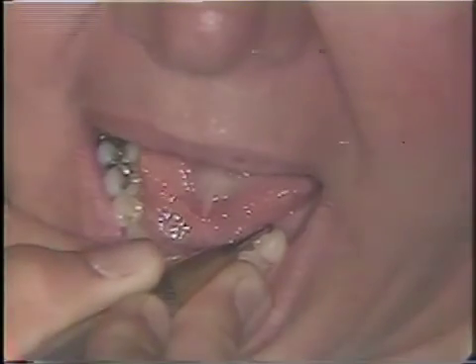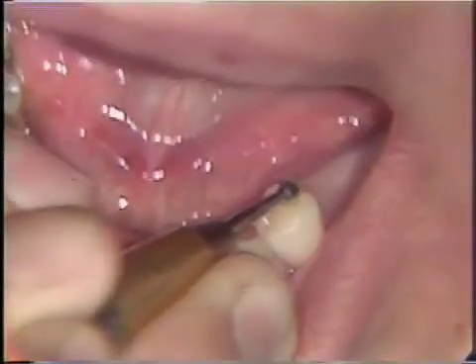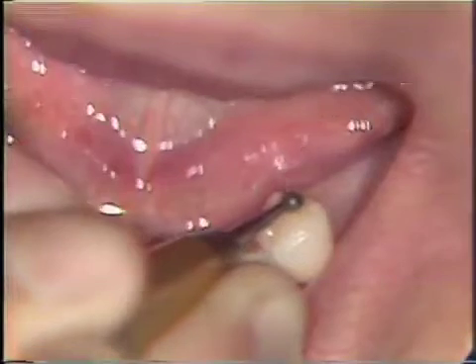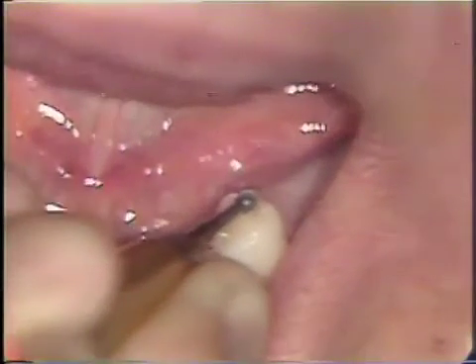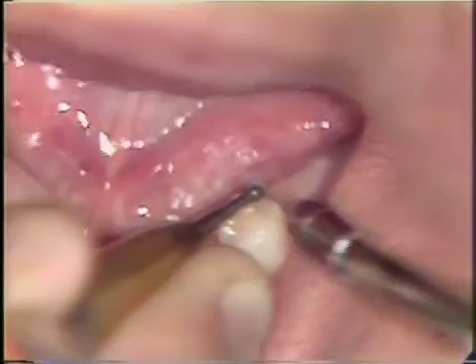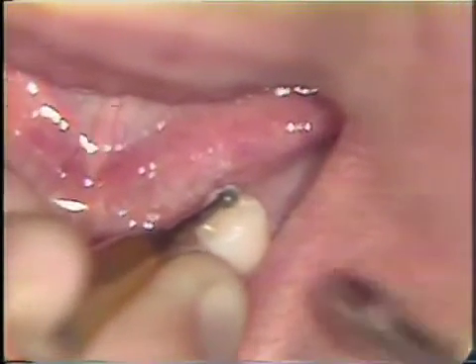On the patient, the occlusal rest is placed with a number 6 carbide burr, round. It could also be placed, if it were on a molar, with a number 8 carbide burr. The patient is not anesthetized for this procedure and it is done at low speed. The patient will feel a lot of vibration, and it is done at low speed so that you will not go through the enamel and into the dentin in a hurry.